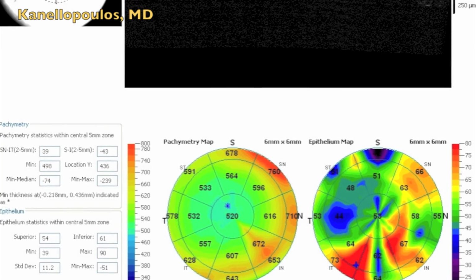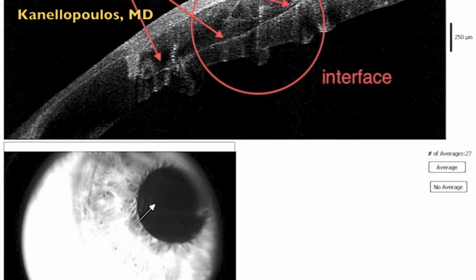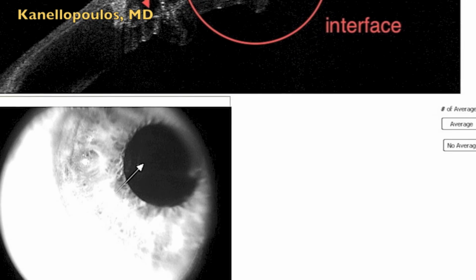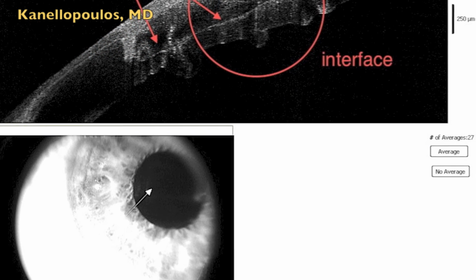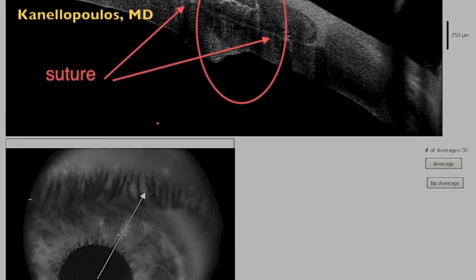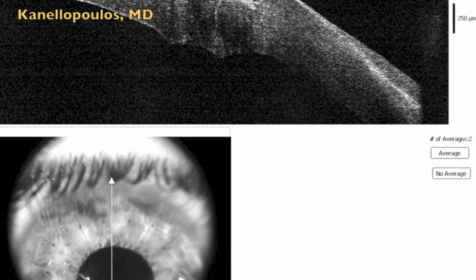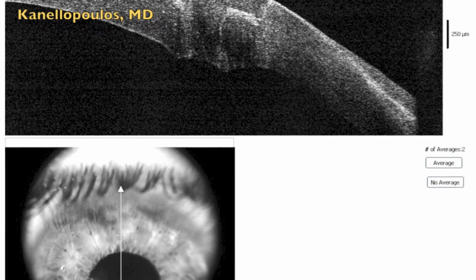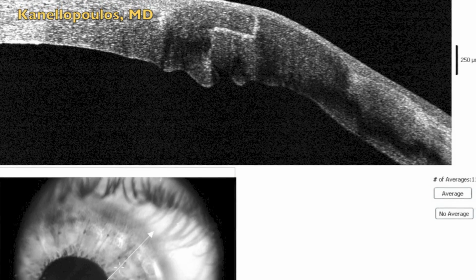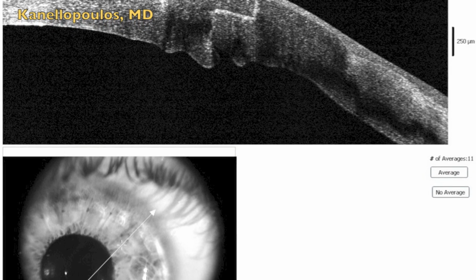Here we're seeing the epithelial remodeling 2 months out, good thickness, and here you can see a suture track with a suture and the step of the graft-host interface. I'll show you one more of these that were eloquently caught by my staff. Again, the step graft-host interface. This is still early in the transplantation procedure. Again, another section where the step between graft and host is very nicely delineated. When sutures are out and a year out, this graft-host interface will be maximal and the best possible.